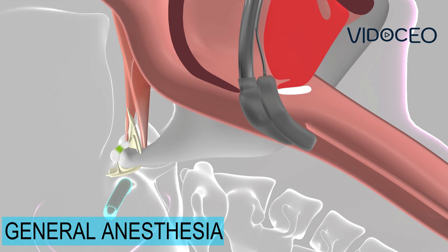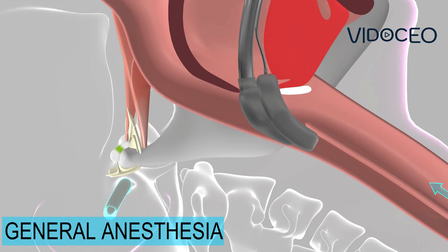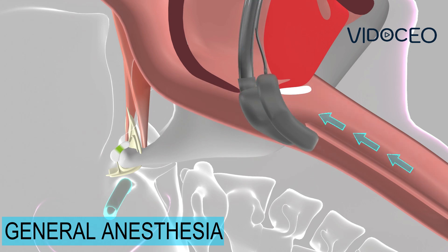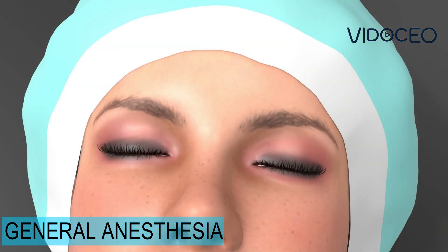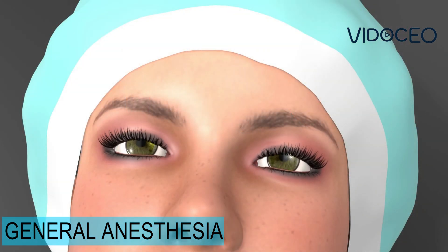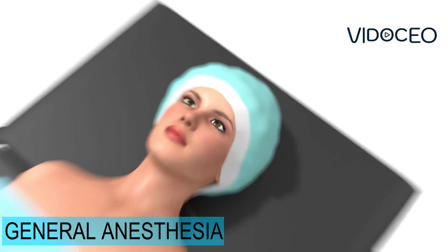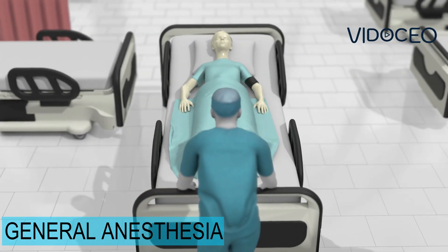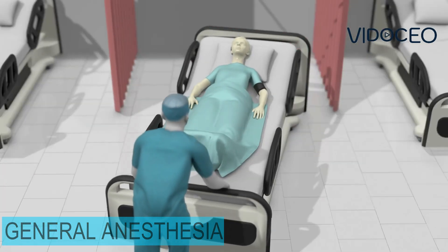Vital signs are continuously monitored and anesthesia adjusted as necessary. After the procedure is complete, the anesthesia is gradually stopped and the patient begins to regain consciousness. Then the patient will be taken to a recovery room to be monitored for one or more hours.